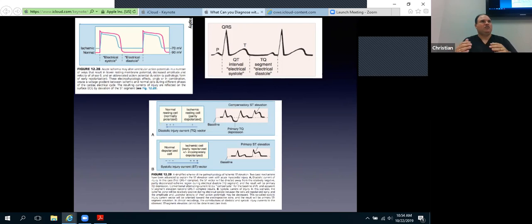of them are 100%, which is why our diagnostic use of EKG for STEMIs is only 50% positive half the time. And the most important thing that we need on our chest pain patients is both an old EKG, so I'll say two most important things are an old EKG, so we have a comparison, and secondly, a repeat EKG. We need serial EKGs. We don't do serial EKGs enough, and it's a blind spot for us again. And it's that way in a number of different hospitals. The reason we don't do EKGs enough is because it takes time and effort.